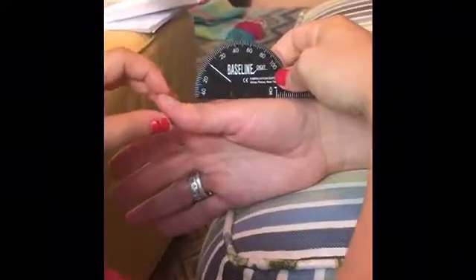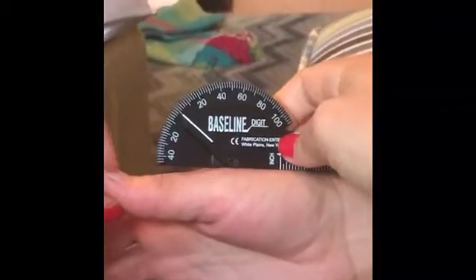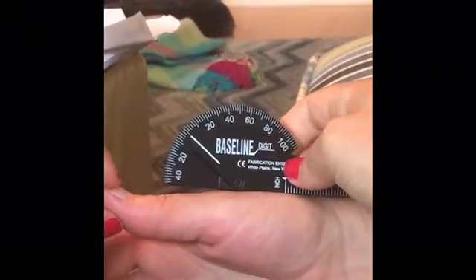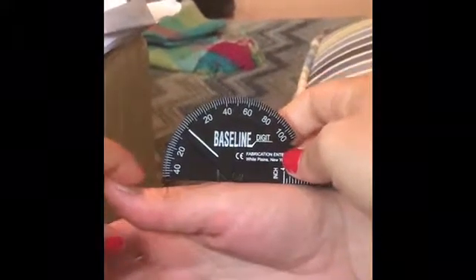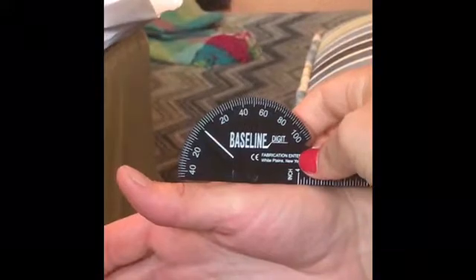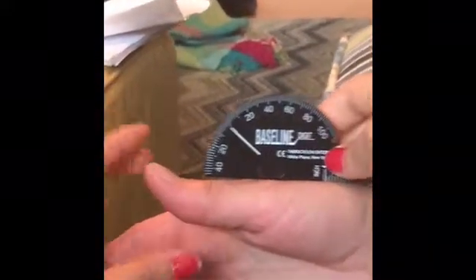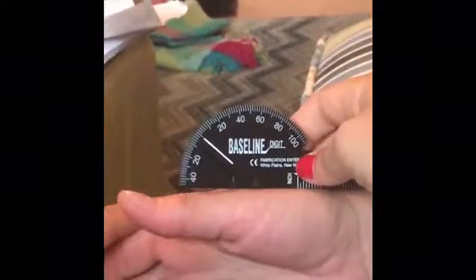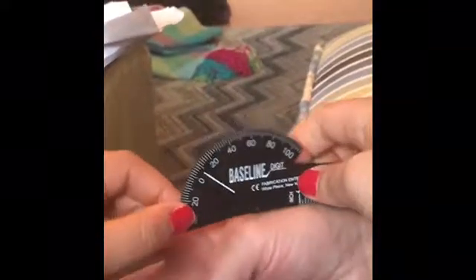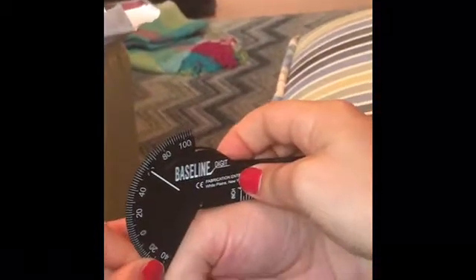We're going to be measuring range of motion of the thumb MCP joint flexion. So range of motion is 0 to 60 degrees. The axis is going to be the dorsal surface of the thumb MCP joint. The stable arm is midline dorsal surface of the thumb MCP joint, and the moving arm is going to be midline dorsal surface of the proximal phalanx. So go ahead and flex. And it's right at 60 degrees.